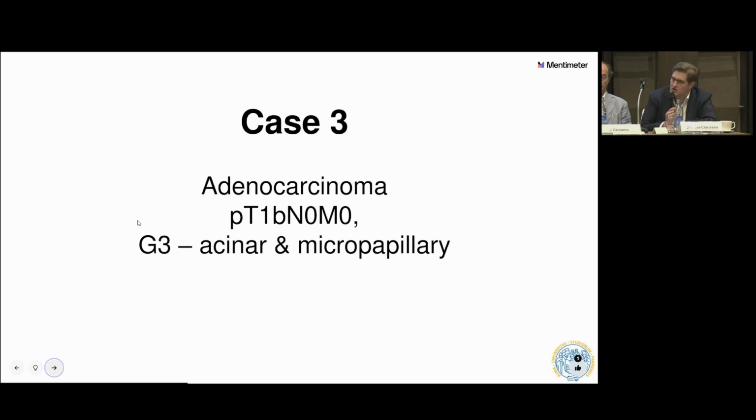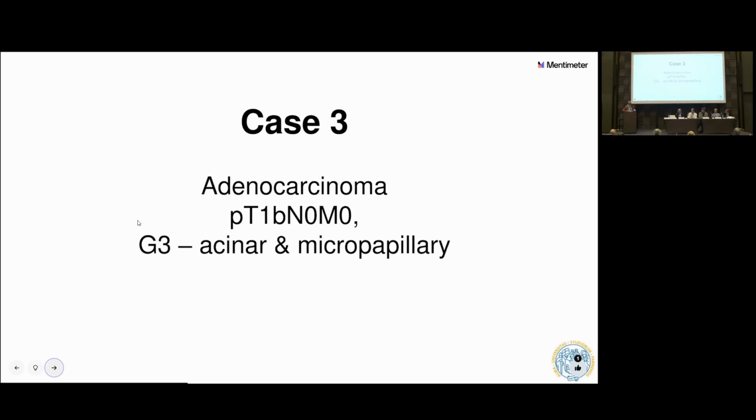And then one thing in Germany is we are very restrictive on ordering PET CTs. You have to have a biopsy result for cancer to do the staging, or for staging biopsy. So at least you try to get a biopsy, then the payers are allowing you to have a PET CT for staging. Yeah, indeed. You made the point, why not another 3-month control? Because we already have a 1-year behavioral characterization here of the nodule.